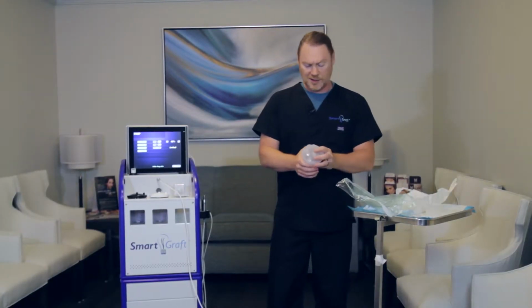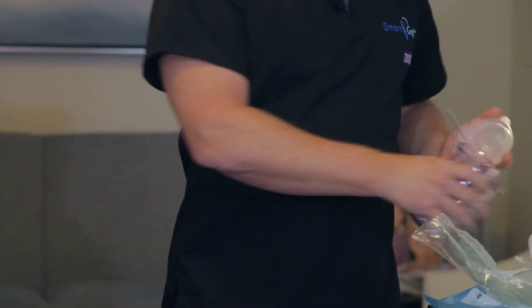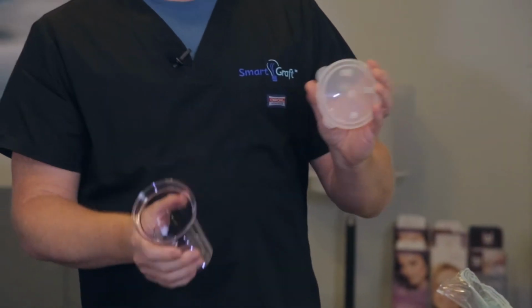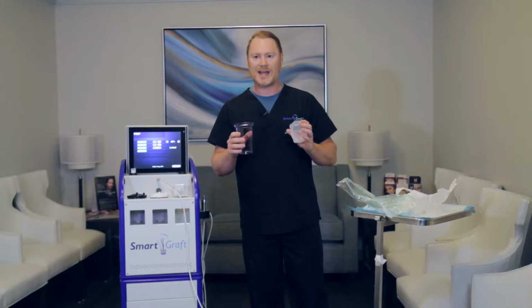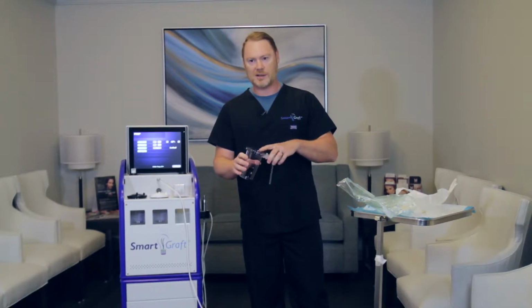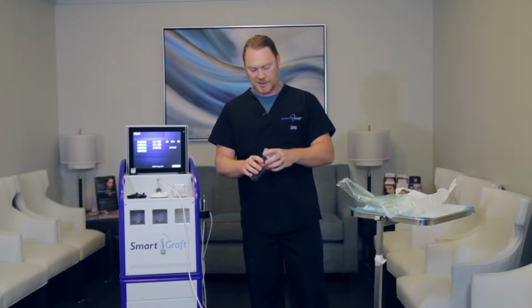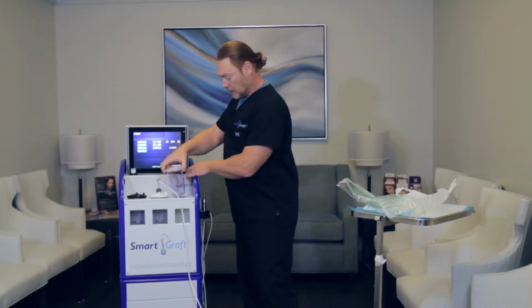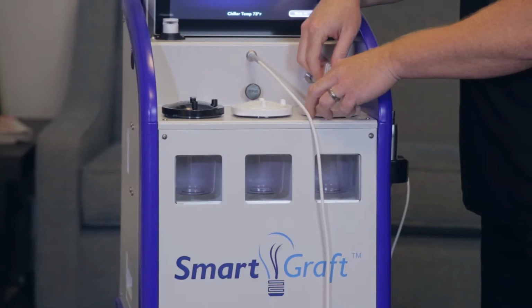This third one actually contains the tubing sets that are going to be connected later. This one has a clear top with a long tube. The reason for this long tube is this is the canister that the sterile saline solution goes into that wets the grafts. Again, put the top on tightly and put that into the third position.